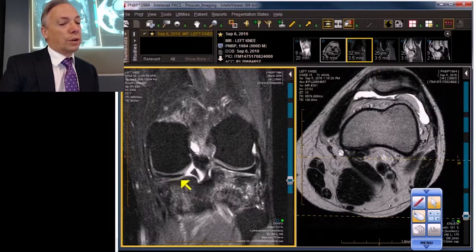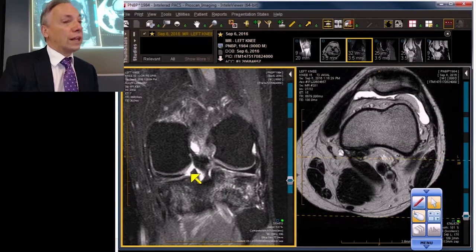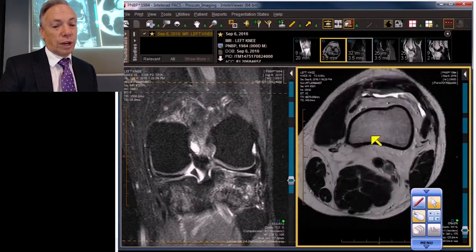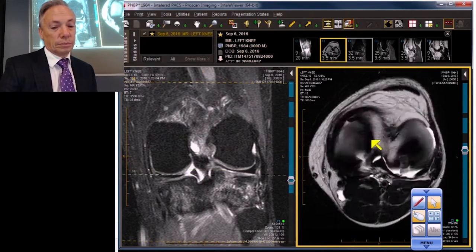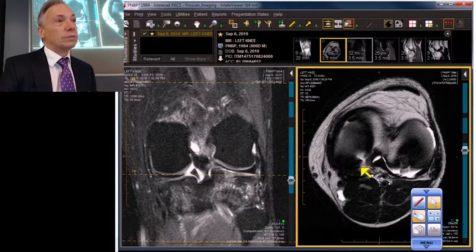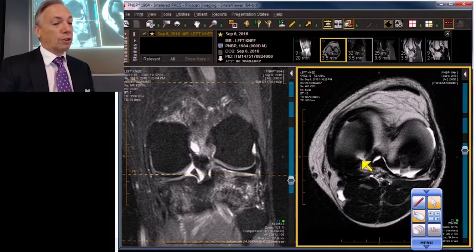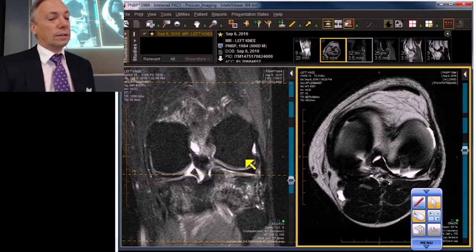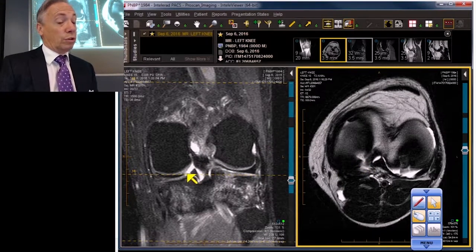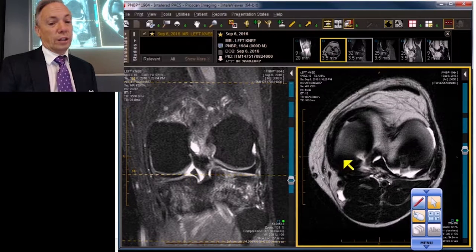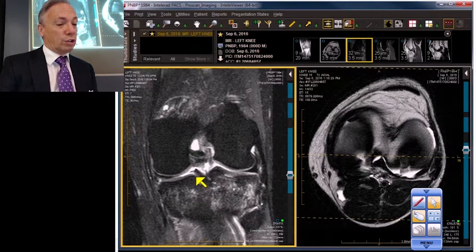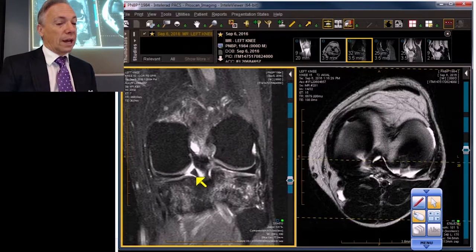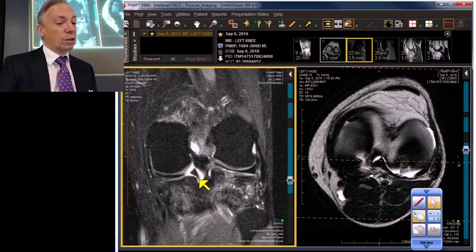But I'm primarily showing it for the radial gap that you saw in the axial projection. Let's go back to it — here it is right here. Often overlooked, but never understated. It's got some width to it, and obviously that width changes from anterior to posterior, so it'll change as you scroll from front to back. And it is just medial to the root attachment.